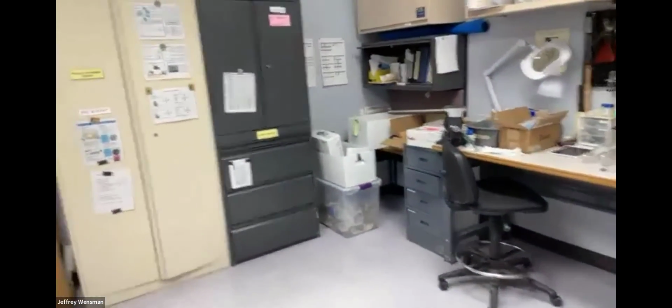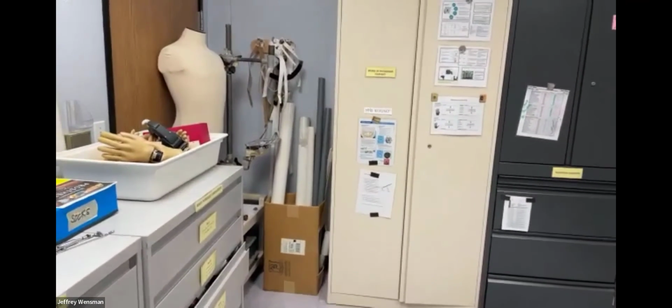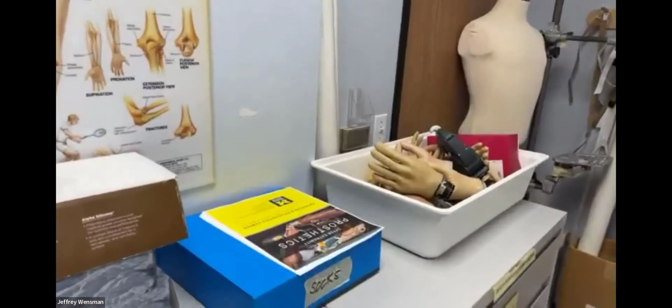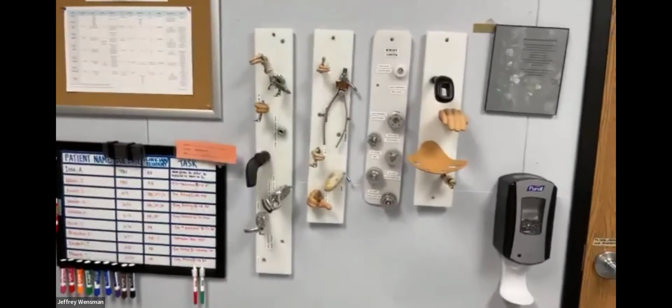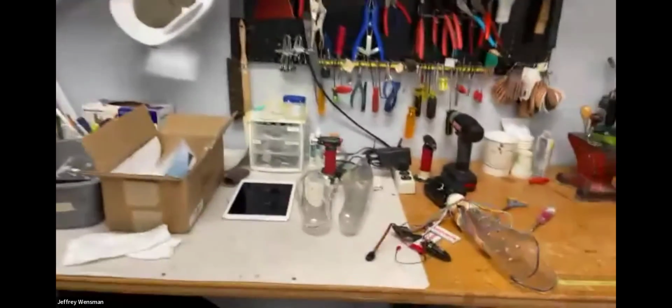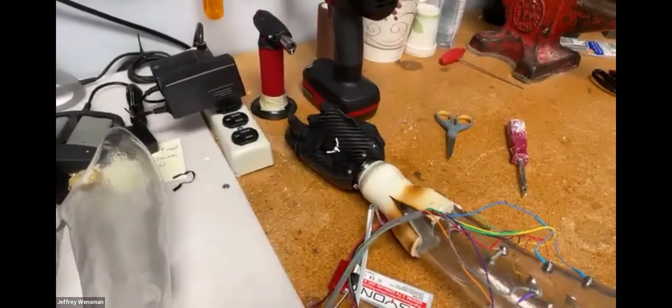And then we'll briefly stop here in the upper extremity room, give you an idea that we do the full spectrum of orthotics and prosthetics. And upper extremity prosthetics, as you probably know, are quite expensive and have lots of small things. So we do everything from myoelectrics down to straight up conventional prosthetics for upper extremities. So kind of anything you can think of, we do here. Here's the check socket, and here's a brand new hand going on a patient this week.